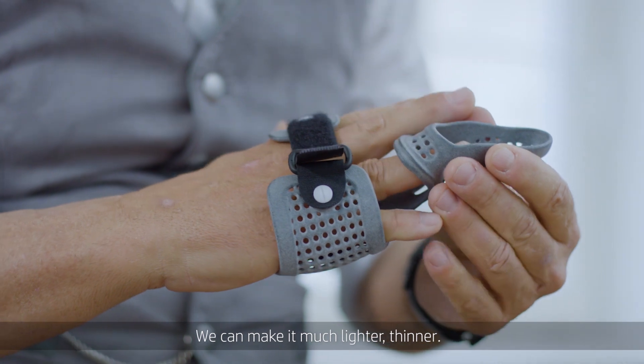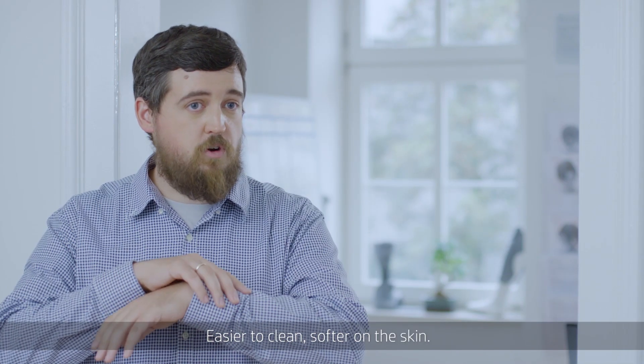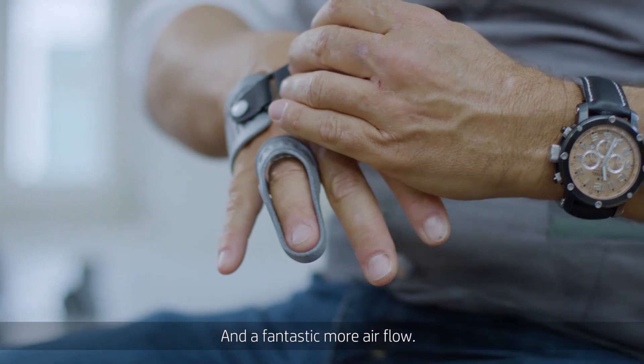We can make it much lighter, thinner, easier to clean, softer on the skin, and with fantastic airflow.